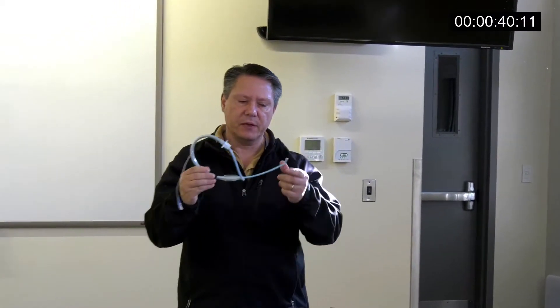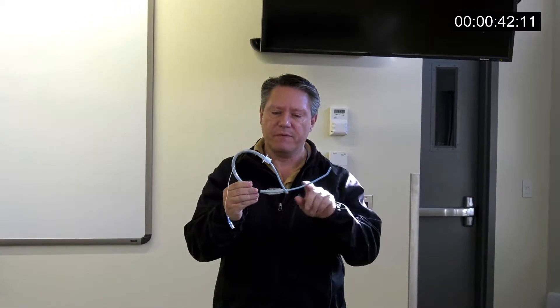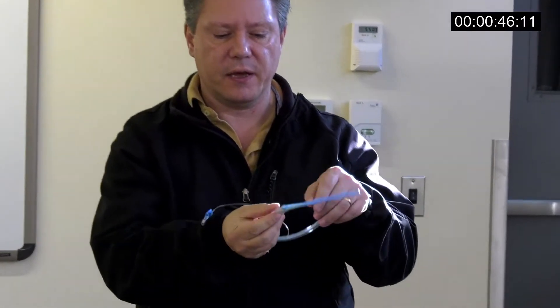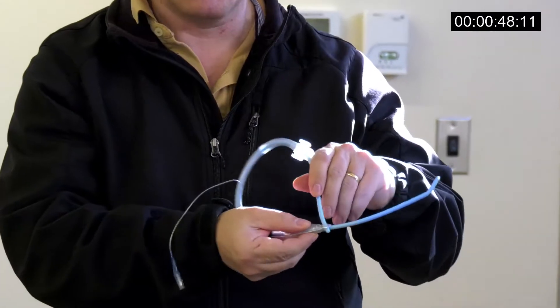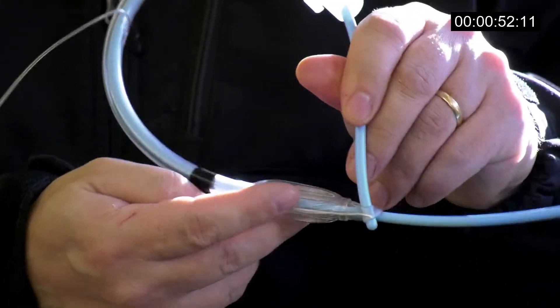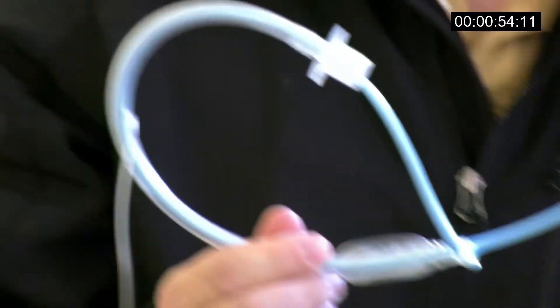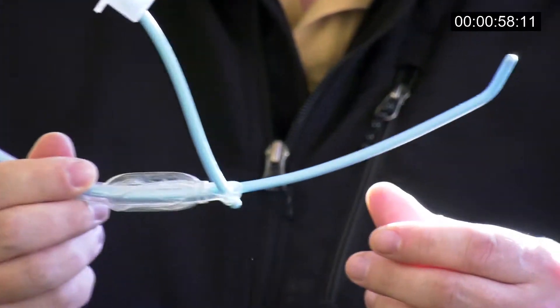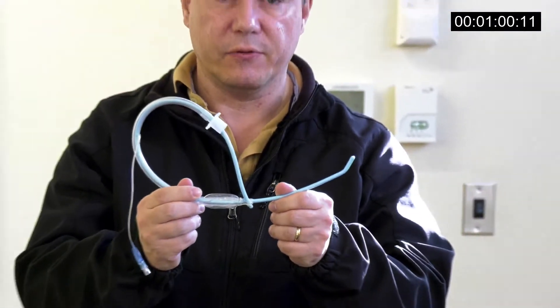Let me show you what it is. Basically, what we've done is we've taken a regular Eshmann and fed it into an endotracheal tube, then we stick the Eshmann through the murphy eye just a little tiny bit, just enough to hold it in there. It works best with a 7.5, but it can work with a 7 and will work in an 8. Once you get below a 7, it's a little difficult to get it through the murphy eye.